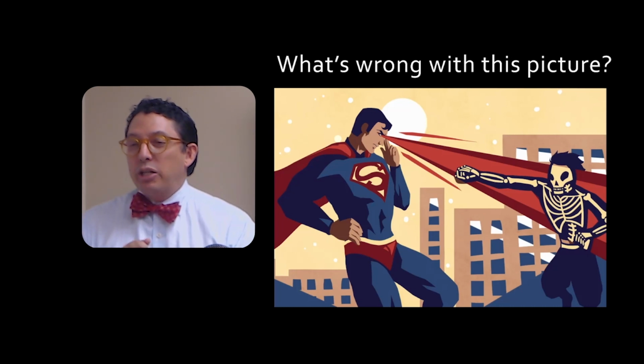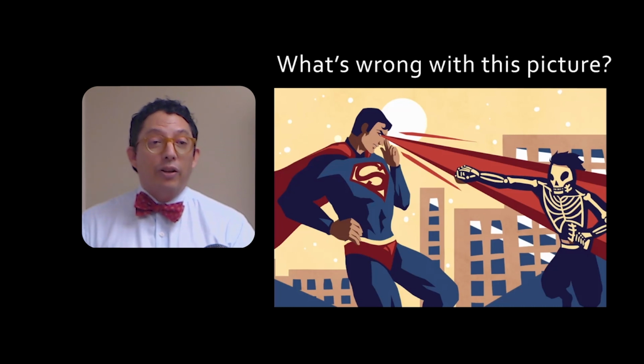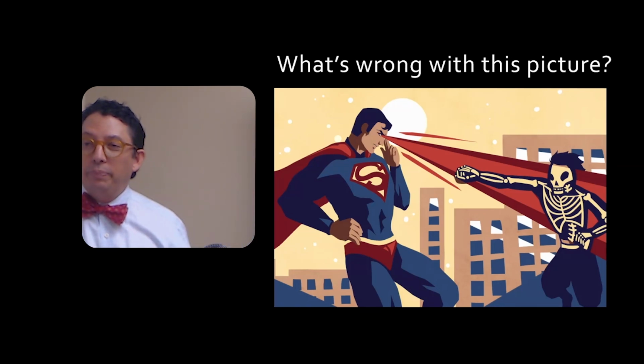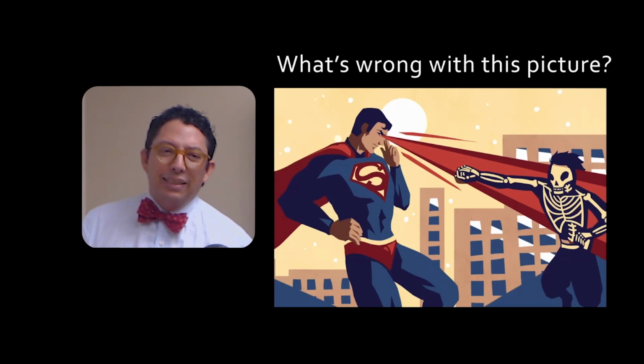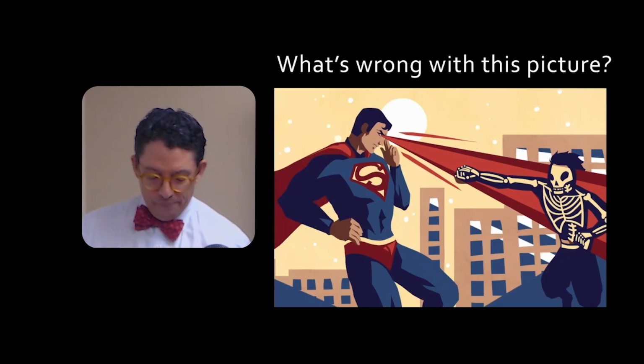Actually, having x-ray vision wouldn't really look like that unless Superman had a super friend on the other side with an imaging detector telling him what was going on. So let's talk about light and let's talk about photons, because that's the principle of understanding x-rays.